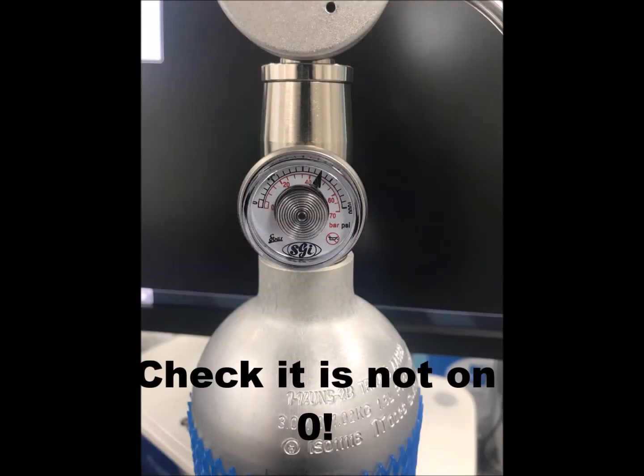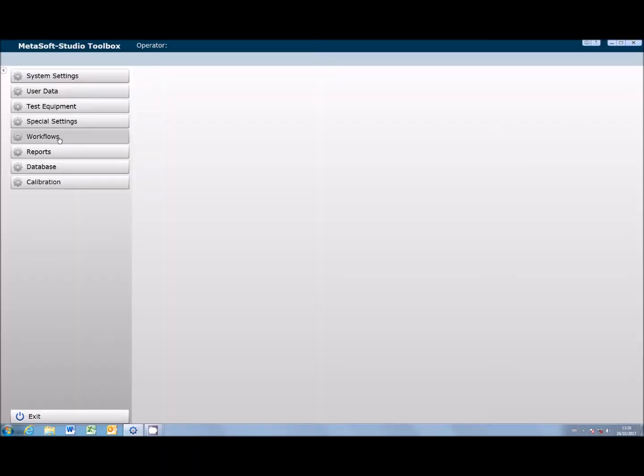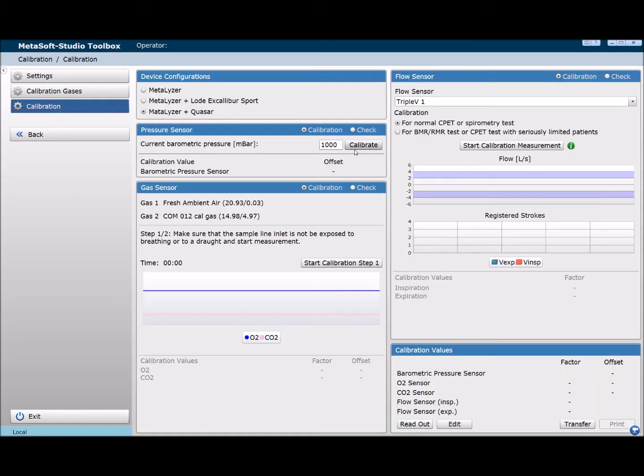Once you have gathered all the necessary equipment, open up Metasoft Studio toolbox and click calibration. Then input the barometric pressure and click calibrate. This will take a few seconds to complete.